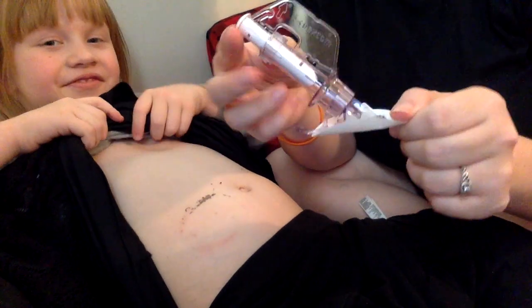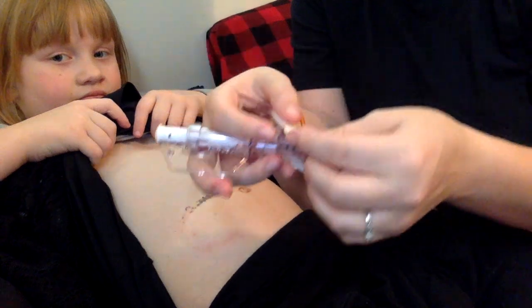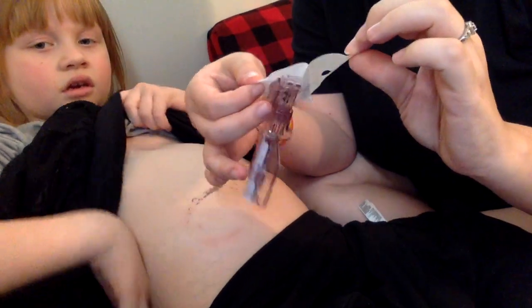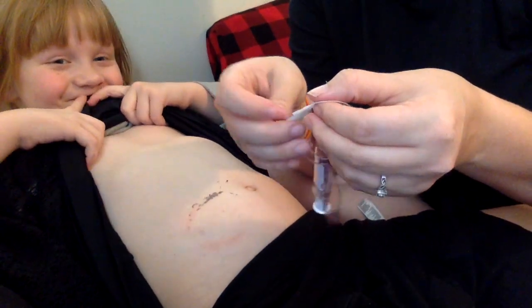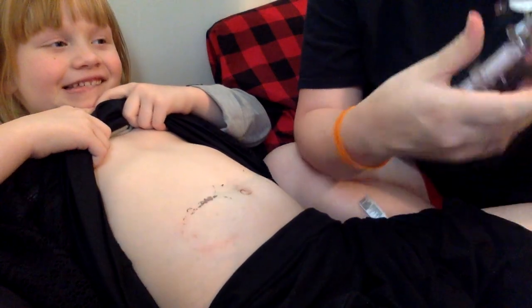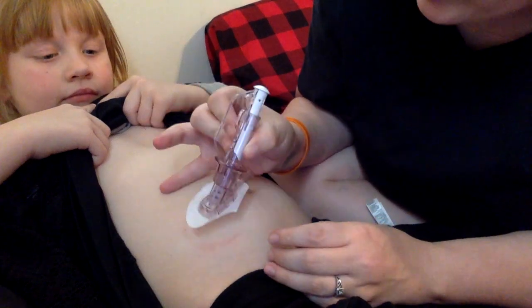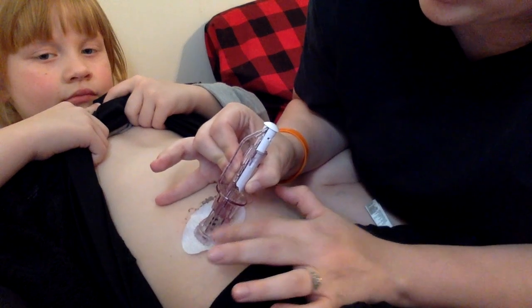Okay, so this is the Dexcom sensor, her plunger. So what you're going to do first is take off the back of the sticky, carefully. I would take off the safety. No, you take off the safety last. You know that. She's being silly. But yeah, you very carefully take off the paper because you don't want to waste it, or you don't want to get this bunched up. It's kind of like tape. Well, technically it is tape. But like when you're wrapping paper or doing duct tape, you don't want it to stick to itself. Otherwise, you have to cut a new piece. And this is not that simple. But anyway, we're going to look for the part that's not sticky, which is right here. And we put it down there ever so gently.